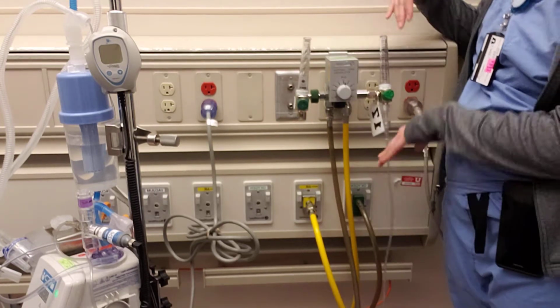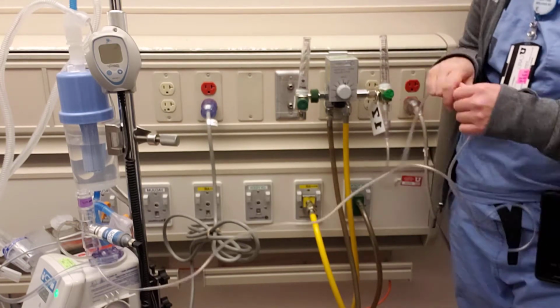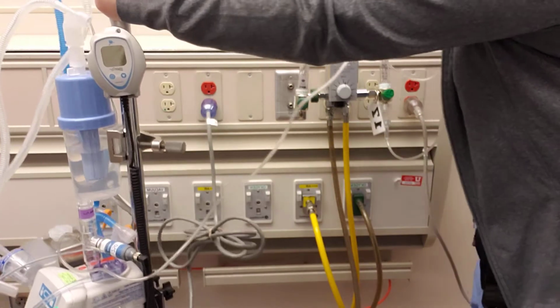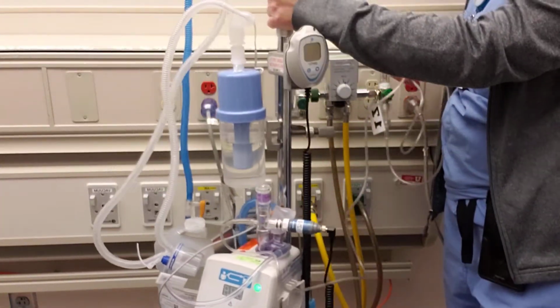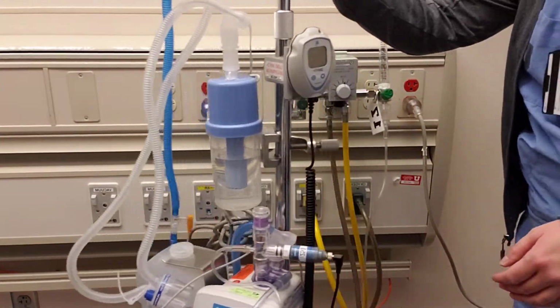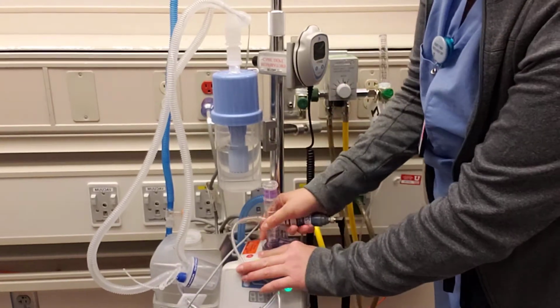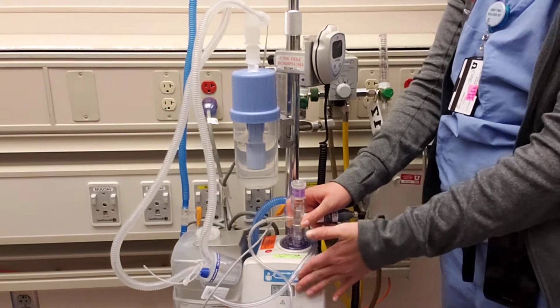Next, I'll bring you guys down. We have our oxygen tubing, which comes down into our actual bubble CPAP. Let me see if I can make this a little clearer for you guys. Okay, so coming down, we have our heater, and again, there will be different heaters.